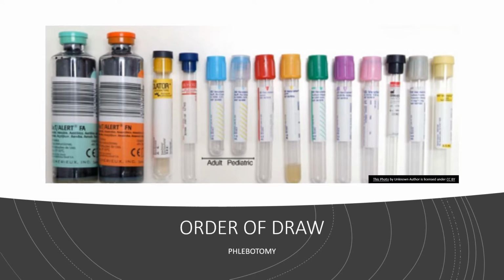So why is it so important that we draw tubes in a certain order? Okay, first and foremost, there can be cross-contamination. As we go through these slides and as you go through class, you'll start to learn all the additives that are in the tubes and what those additives do. And then you can start understanding that if one additive gets into another tube, it can lead to invalid test results.